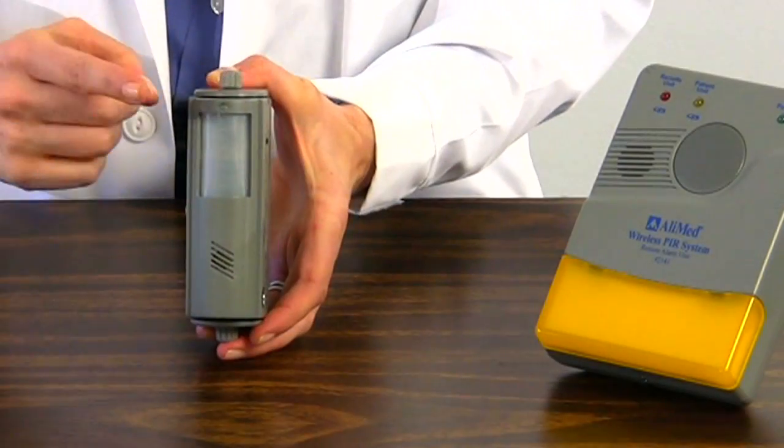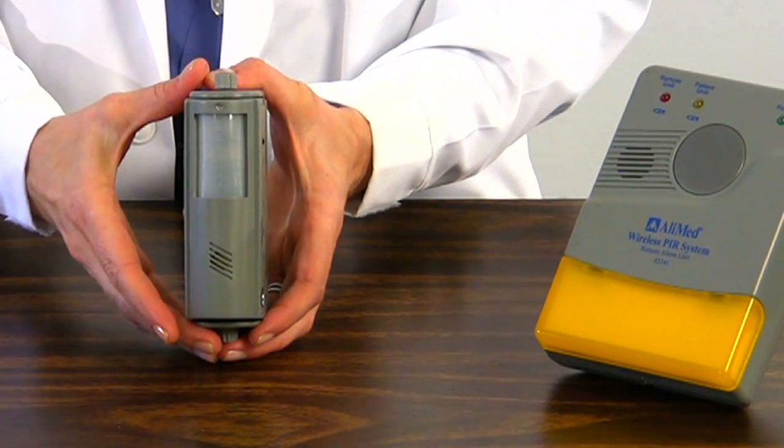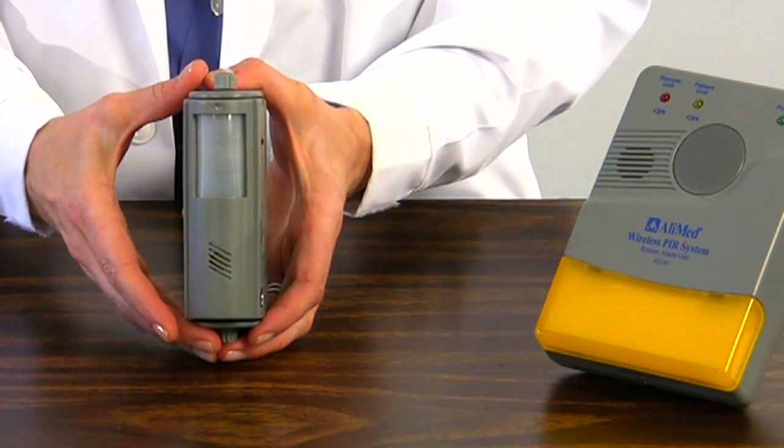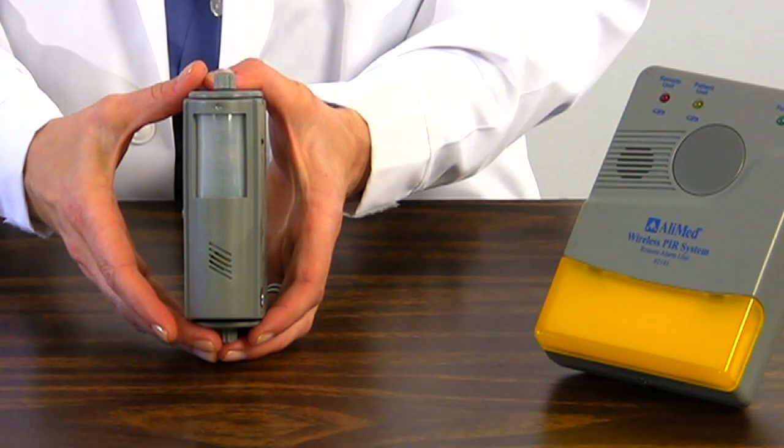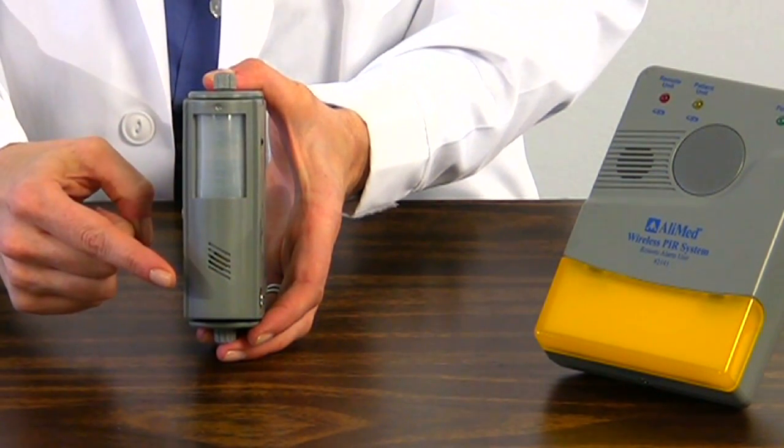On the front of the alarm is the sensing area. This is the part of the alarm that emits the invisible infrared sensing field. Be sure this is the side facing out when the alarm is in use. On either side is the low battery alert light and the speaker where the local alarm sound is emitted.